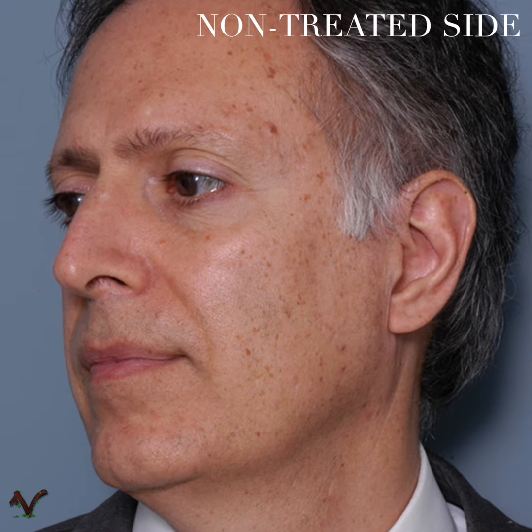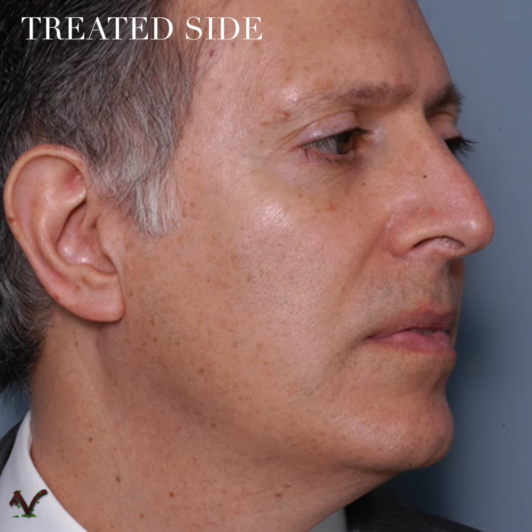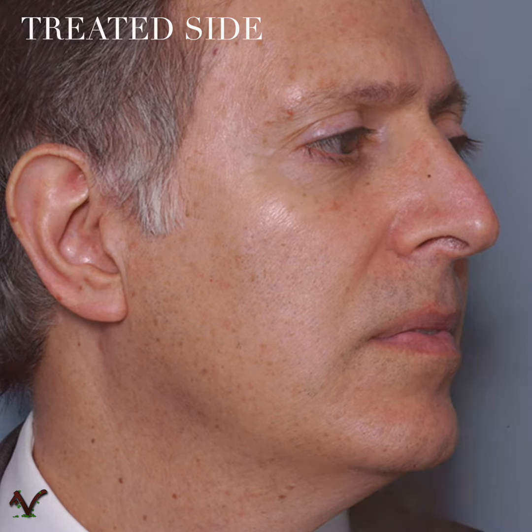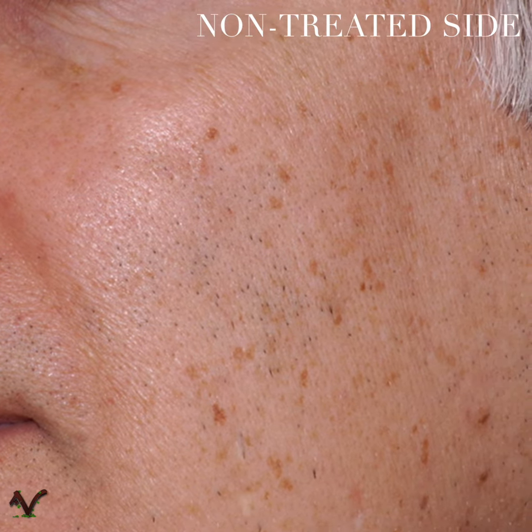So what I did is I treated half my face and just compared it to the left side. I treated my right side twice. It is supposed to be done once every four weeks for three or four times, so I've only done two sessions, but I'm really excited about the results.